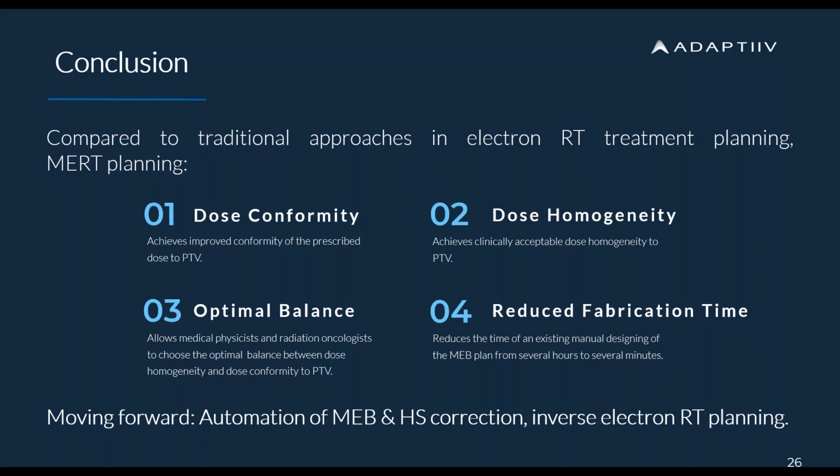And I explained how we find the peaks in our algorithm. They would have to intersect the peak search margin around the hotspot, because not every peak will give you a hotspot. Of course, the most usual way of actually getting a hotspot in the treatment plan is when you have adjacent peaks and the valley in between.